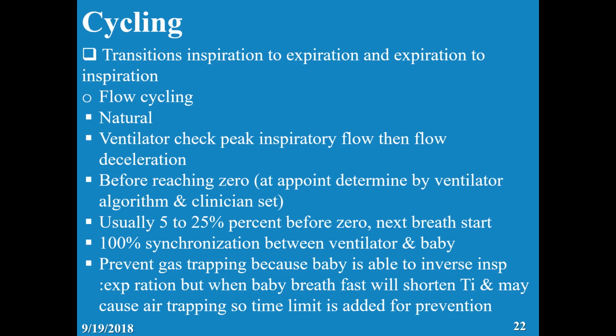So whenever there is tachypnea, especially more than 60, you need either to sedate the baby or switch the mode from PSV to another mode to prevent air trapping. So PSV with a rate more than 60 is not good. Clear?